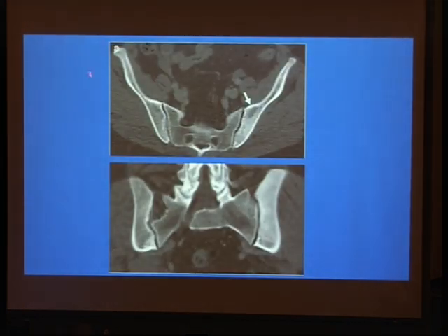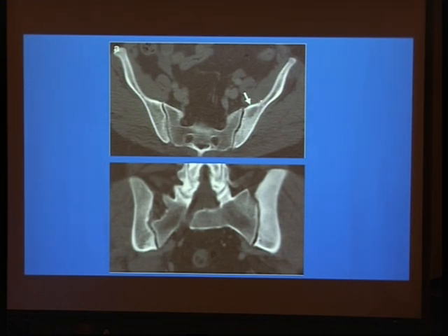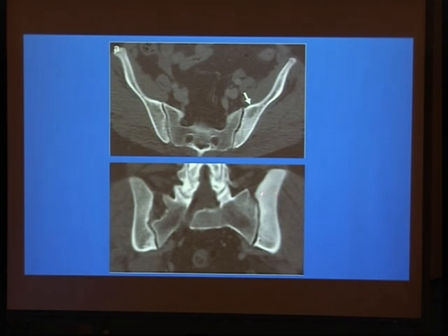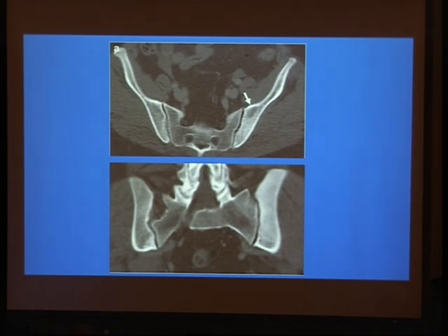Also, on CT, bone sclerosis can easily be diagnosed — prominent bone sclerosis on both sides, with subperiosteal bone resorption also secondary to hyperparathyroidism. And these osteosclerotic changes secondary to hyperparathyroidism are easily diagnosed on non-contrast CT.